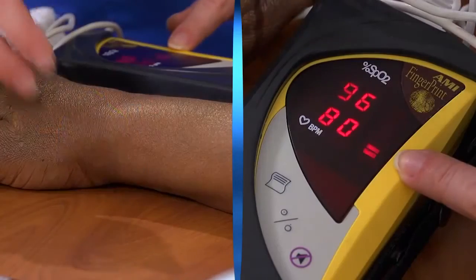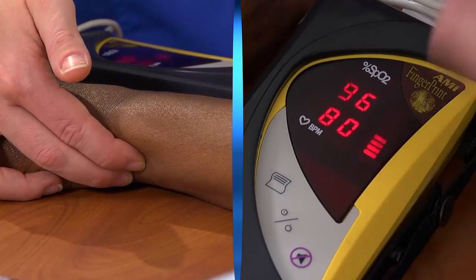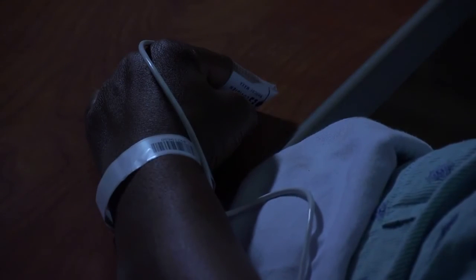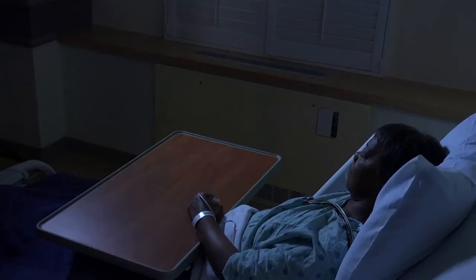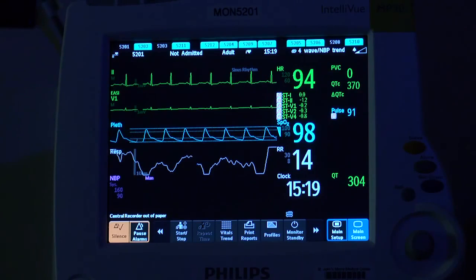Then read the peripheral oxygen saturation, or SpO2, on the digital display. For continuous monitoring, adjust the alarm limits for the SpO2 and pulse rate based on the patient's condition and/or health care provider's orders, and verify that the alarms are preset and on.